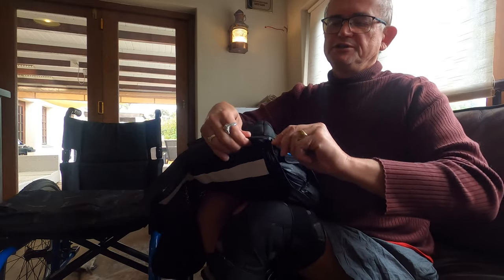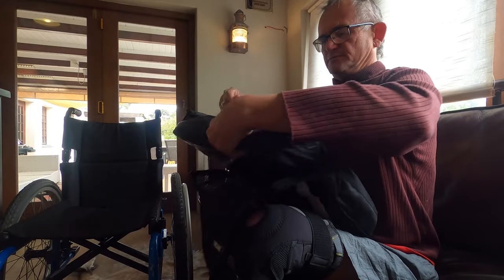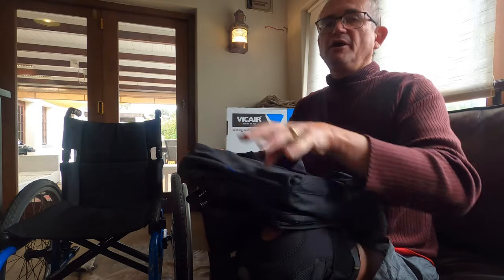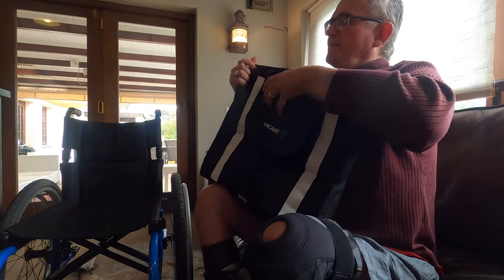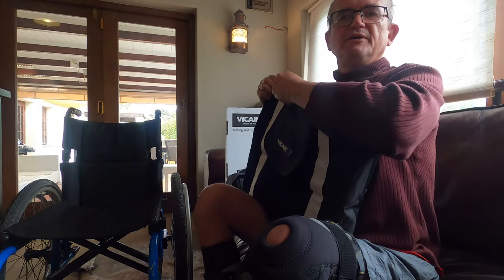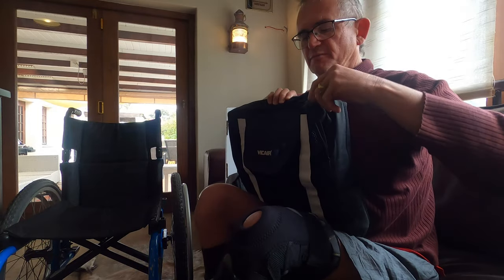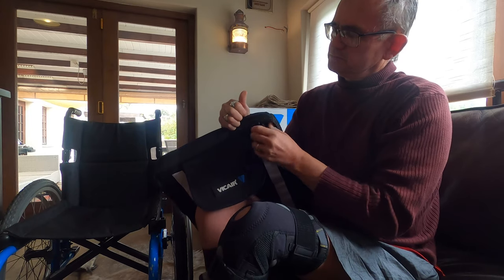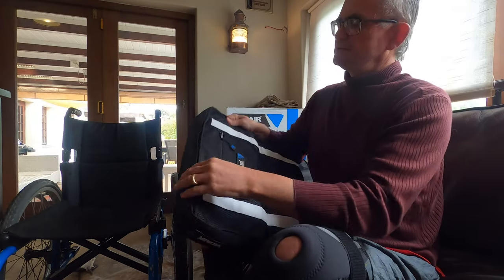Good quality zip so far — no issues, easy to pull. For me with full hand control it's fine, but if you don't have complete dexterity you might need some assistance. One thing I would have liked is to have a zip on both sides. I don't like pulling a zip all the way across — I would have preferred a zip coming from both ends meeting in the middle, so it's easier to find. I'll only know about the long-term quality of the zips in a while, but they feel sturdy.